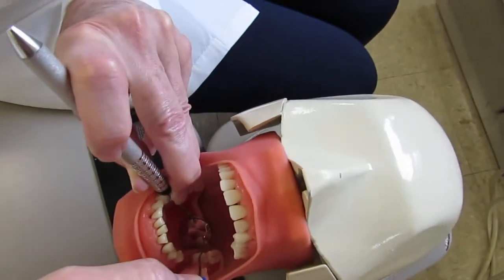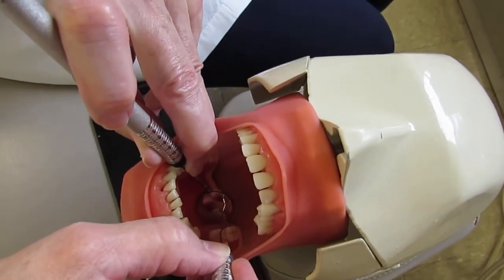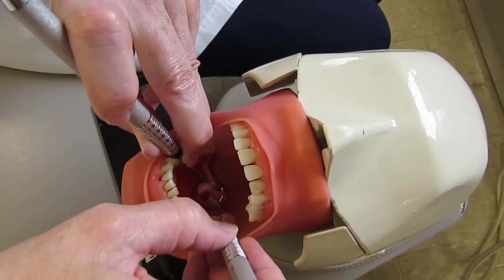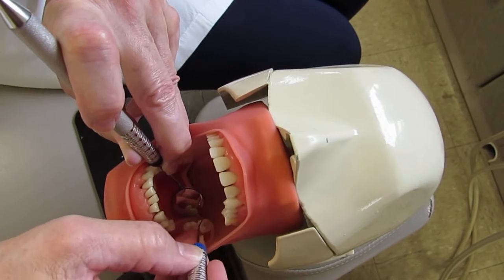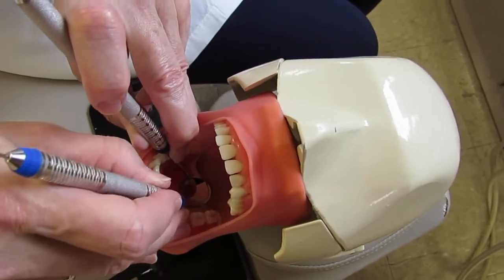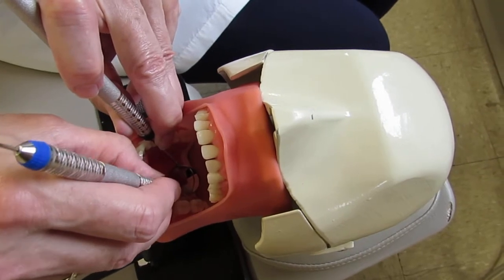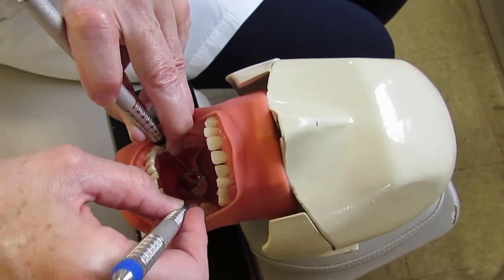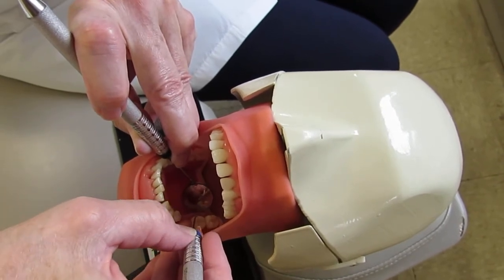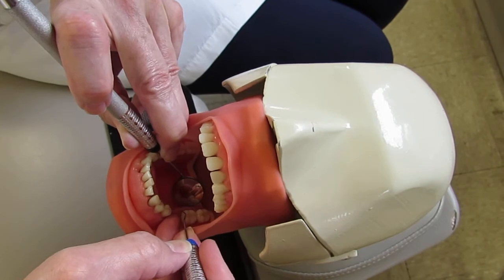Same technique: get ready zone, tilt for insertion, rolling, getting tall on the fulcrum, shank getting parallel. Come out, quarter turn, then get ready zone and insert again. Come across that wide lingual span, rolling, anticipating the line angle, going halfway across that tooth.